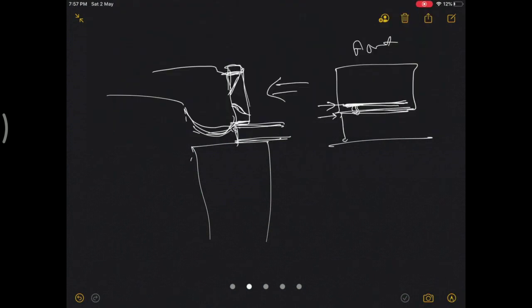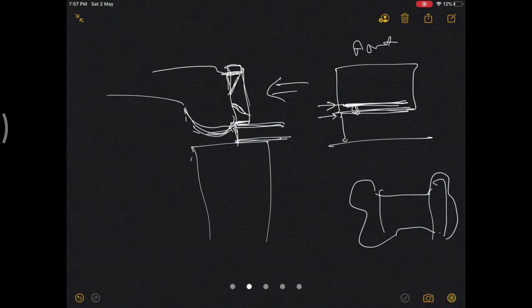This is a negative block, which is on the opposite side of the block. So the other side will usually be a couple of mm less than anticipated, considering there is a loss of 2 mm below this saw capture. Many people use this negative block, and they balance it and take a cut. So you have flexion and extension gaps equal, and then you prepare it with the 4-in-1 block.